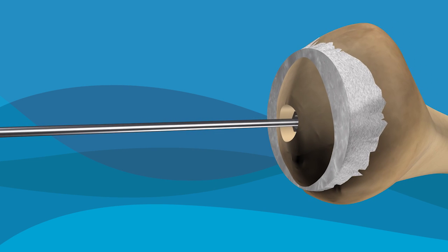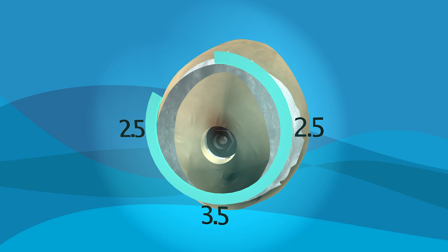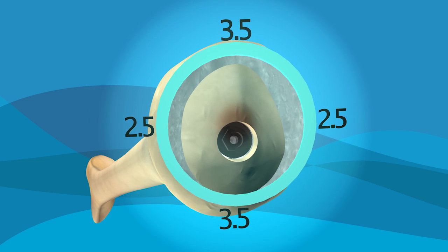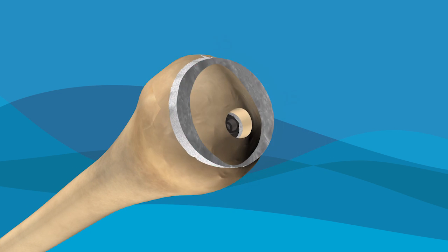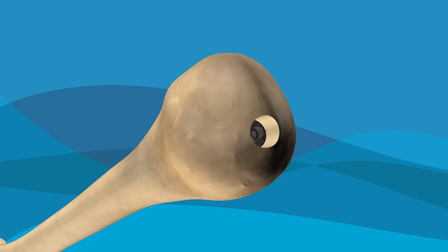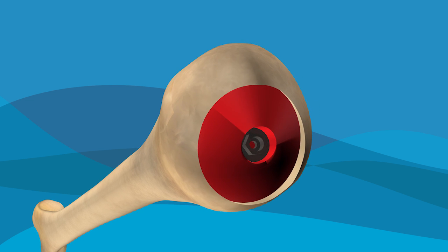Using a system unique to Arthrosurface, the surgeon maps several data points on your joint surface to measure the unique curves of the damaged joint. This ensures that the implant will be a perfect fit. The surgeon then prepares the surface by means of a specialized reamer, smoothing out rough and damaged areas, and creating a socket where the new implant will be placed.